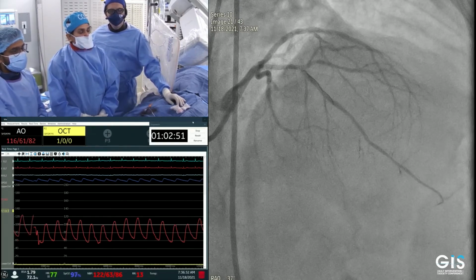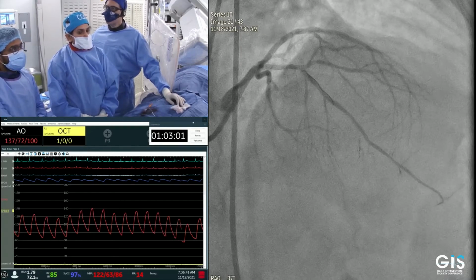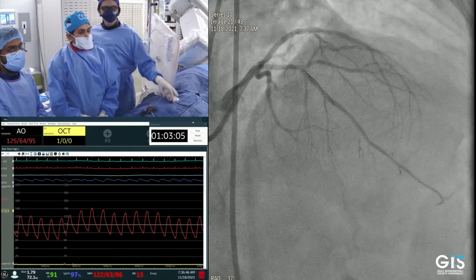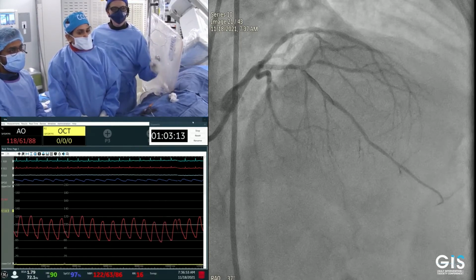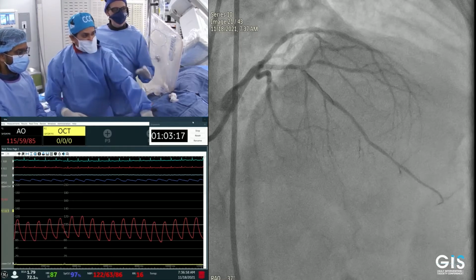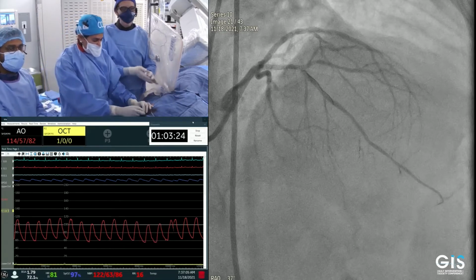Dr. George, your strategy is to do a one stent strategy? Well, if you are going to do a two stent strategy, you have to make an OCT for the diagonal as well. Professor Sopki jumps in to the next subject now. We forget the calcification and the OCT. We go now to the bifurcation. We have another app to decide what's the step-by-step for fixing a bifurcation. Do we have any slides about the bifurcation? We can go there now and we can have some discussion about what we think.